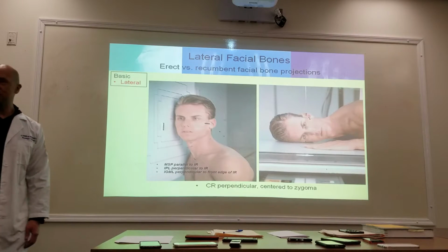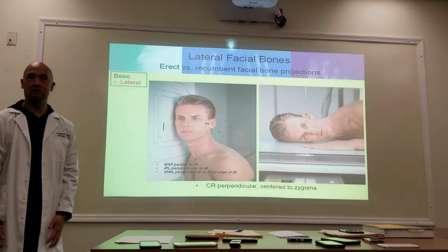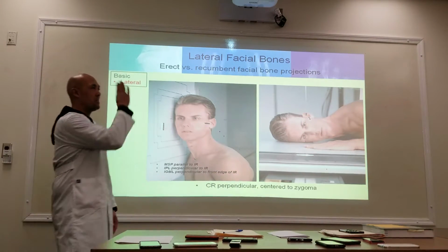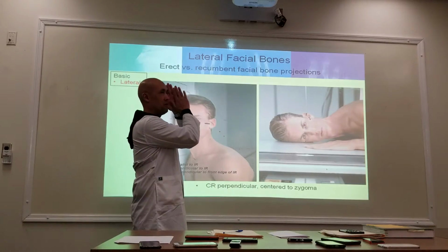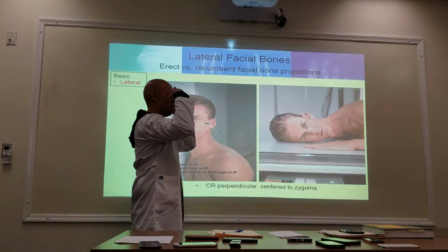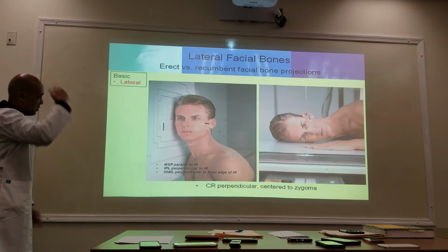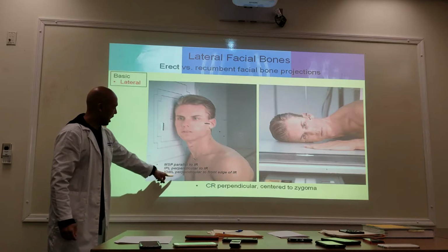All right, so lateral facial bones. You guys already know this. Mid-sagittal plane is going to be what? Parallel. Interpupillary is going to be? Perpendicular. Okay? What it's also saying here is we also want to use the IOML.